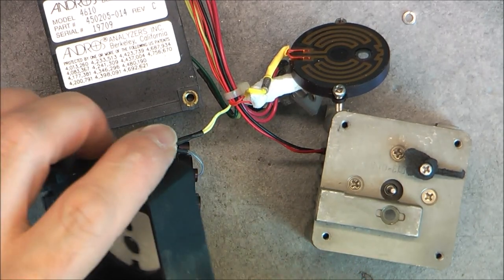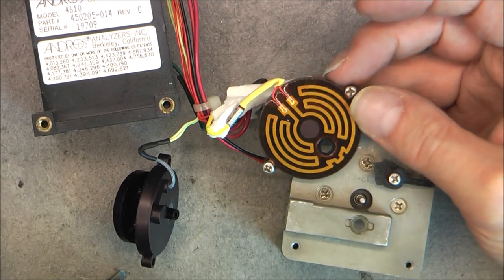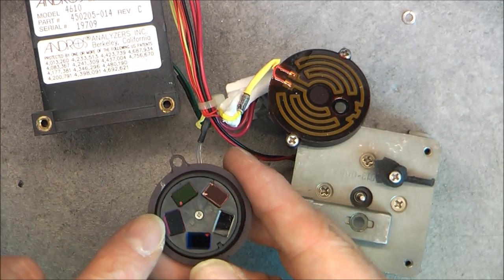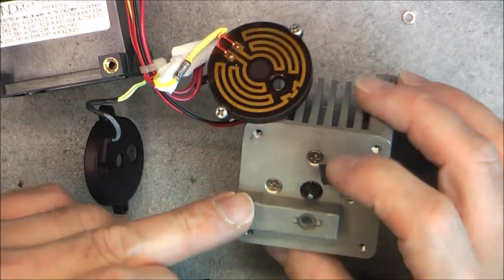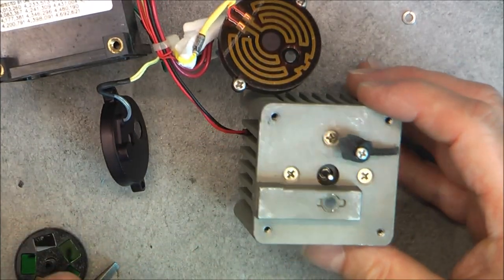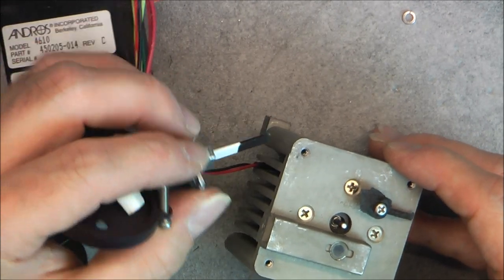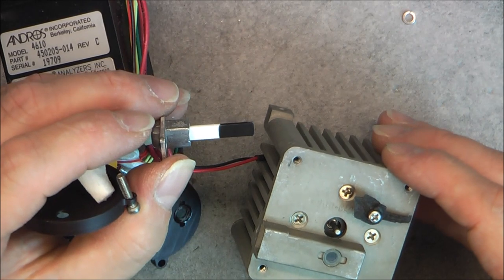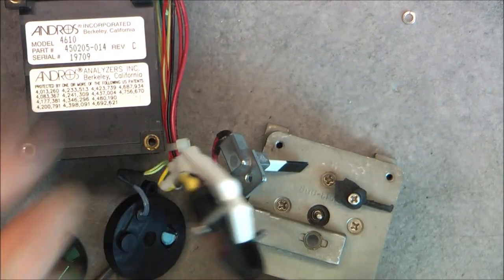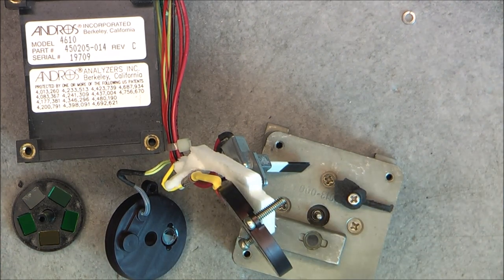Oh, no, I know. We had a screw here which I did break, and this is actually the motor winding, it seems, that will actuate somehow this filter wheel. Oh, no, excuse me, here we have one more motor and one light source. Actually, okay, I get this. This is a light source, not a temperature sensor. Interesting. Really interesting, even. It will require some reassembly.